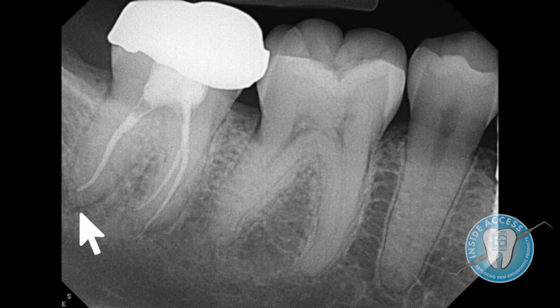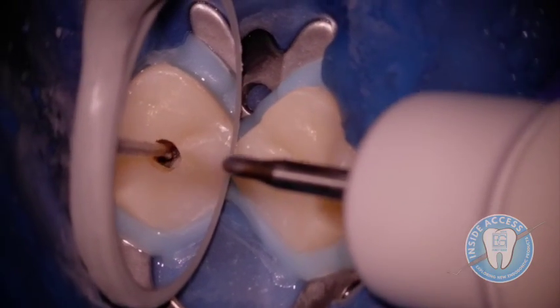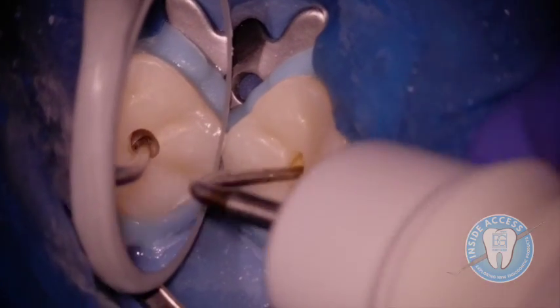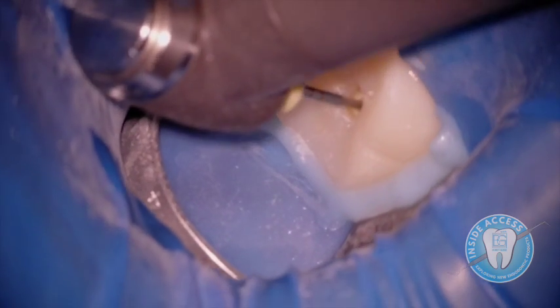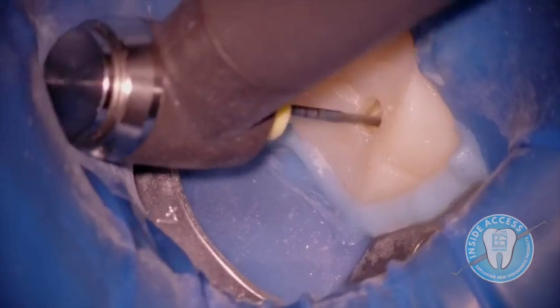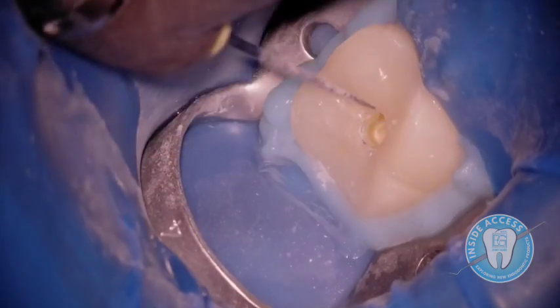There are some clinical uses of the SS White Exact Taper HDC that are a little off-label, one of them being retreatment. In this case we have a lesion on the distal. I'm softening the gutta-percha with a System B tip to begin removing the GP at the orifice — this is selective retreatment of the distal root only. Now the SX at 15/09 — I find this to be an excellent penetrator of GP. I'm using it at 1000 RPM for the retreatment.